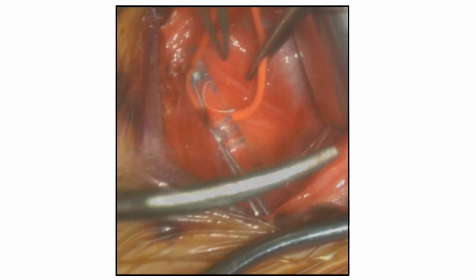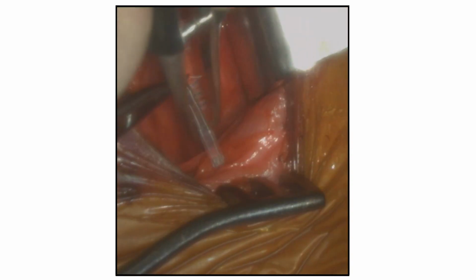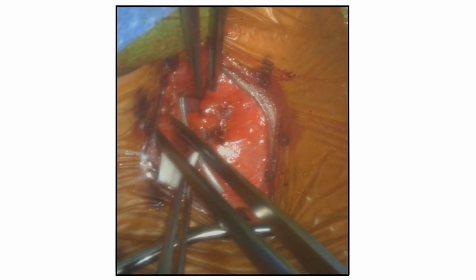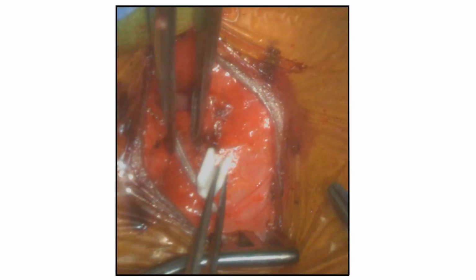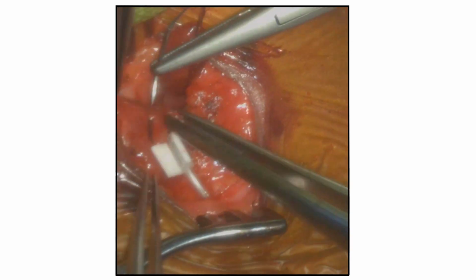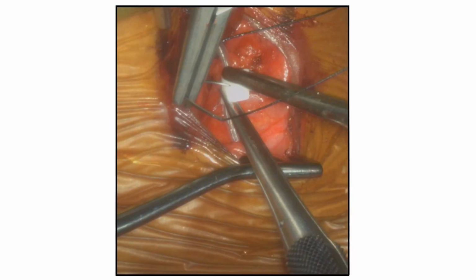The vessel loop is then cut and removed. A few centimeters of cable is pulled into the cavity to prevent any tension. The cable is then secured to the deep cervical fascia.